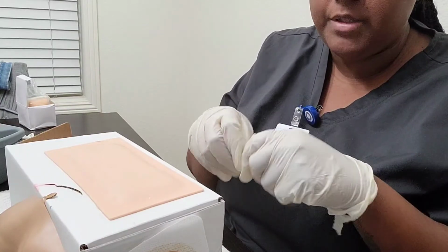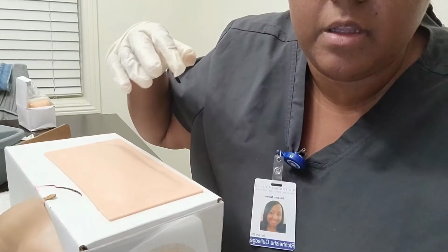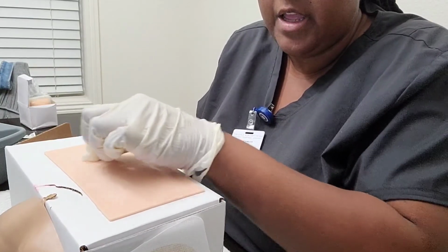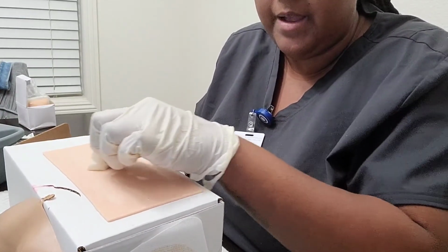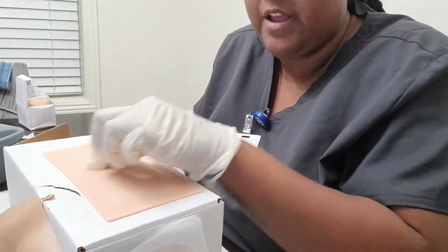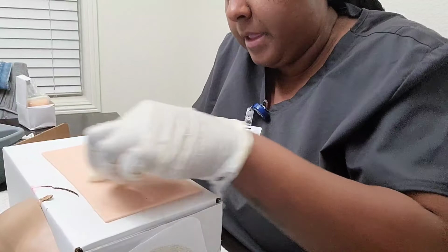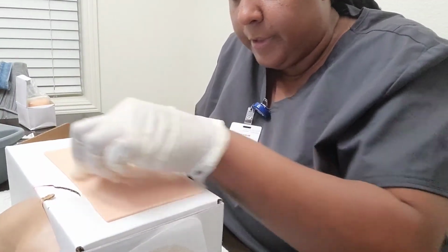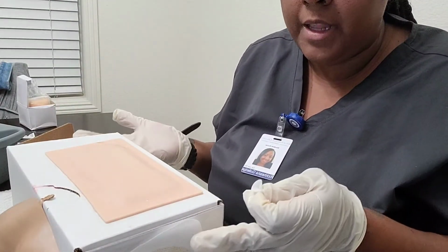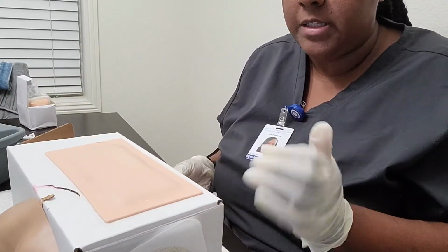Then I will go ahead and take an alcohol pad, and in the center of the site I will start cleansing, and rotate the pad outward in a circular direction for about 5 centimeters or 2 inches of the area. Okay. And then I will allow this to completely dry. I will not blow or wave on it. I will let it dry on its own.